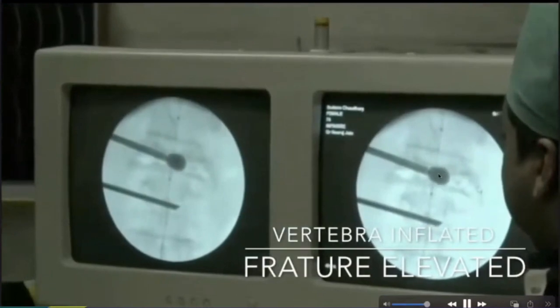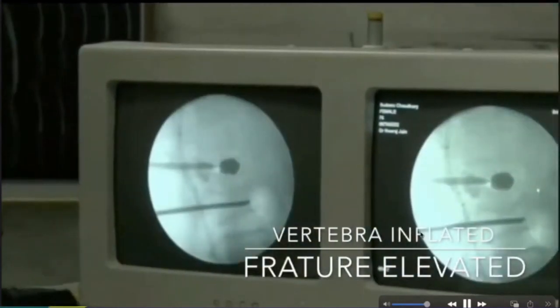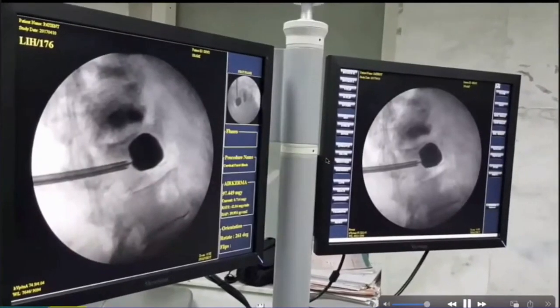Another place where vertebroplasty is required. Not all vertebral fractures need kyphoplasty. This one is good for vertebroplasty. This one is good for Kyphon because there's a lot of collapse. You can just see there's a lot of collapse. There's some retropulsion also. That's why the balloon was there. And that is how it looks. So rosy, so nice. You can inflate.